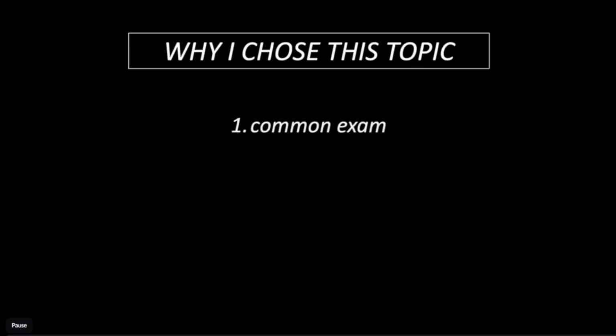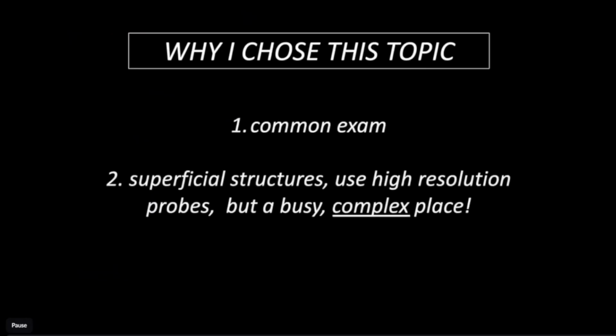Why I chose this topic? Well, it's a common exam. Superficial structures, we can use high-resolution probes, but it's a really complex, busy place, so you really have to know what you're looking at. Plus, I asked Karen what people requested, and it was on the list at the time, so I figure it's a win-win.